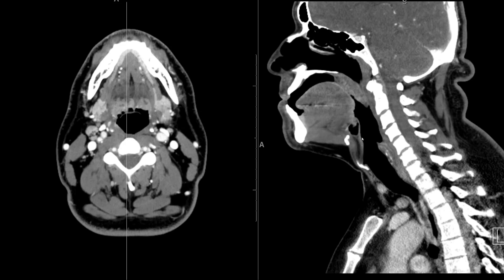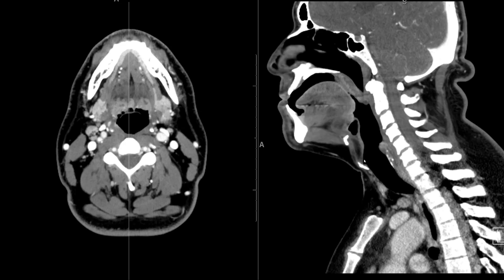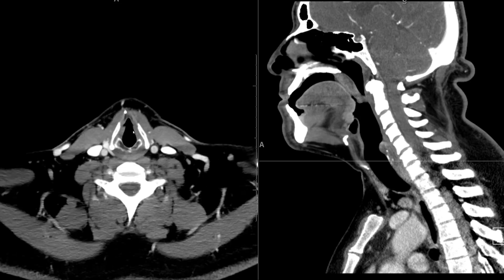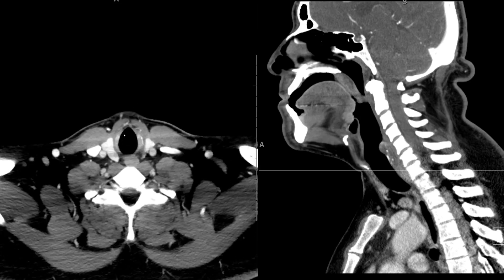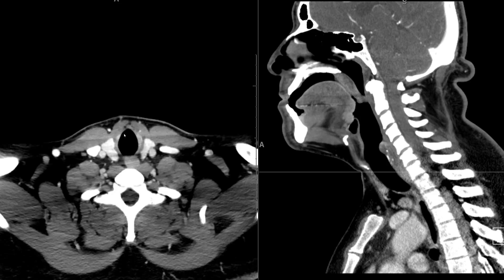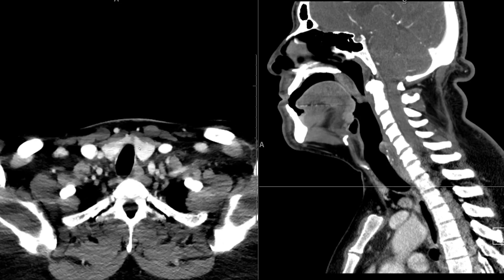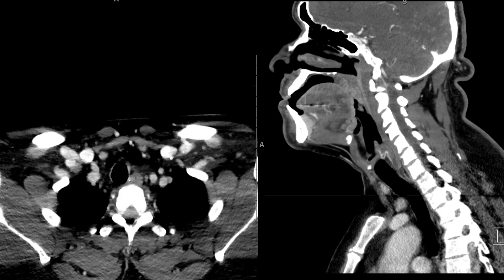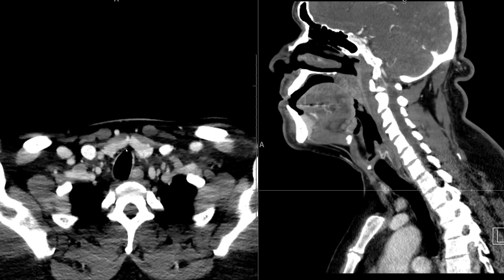Anteriorly, we're in the larynx. First is the supraglottic larynx, then we enter the glottic larynx where the true vocal folds are, at this level right here. As we go below that, we enter the subglottic larynx, and shortly after that, we're in the trachea. Here's the trachea, and depending on the calcification of the tracheal rings, we can see them here anteriorly. This patient is fairly young and doesn't have very much calcification.